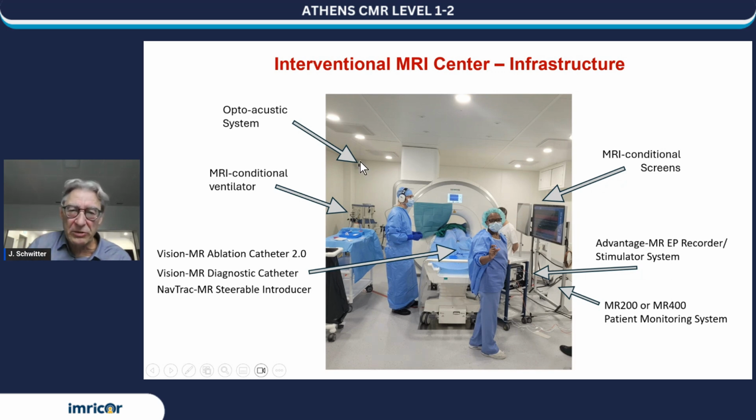So you can communicate with this system here with the headset, because you can have some noise when you do scanning. If you don't do scanning, there is usually not a noise. And then you need also an MR conditional ventilator, which is here. So we intubate the patient from the back of the bore.